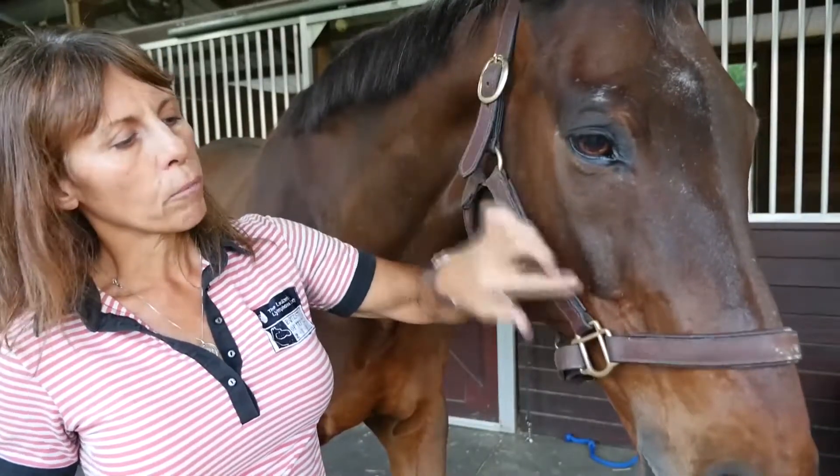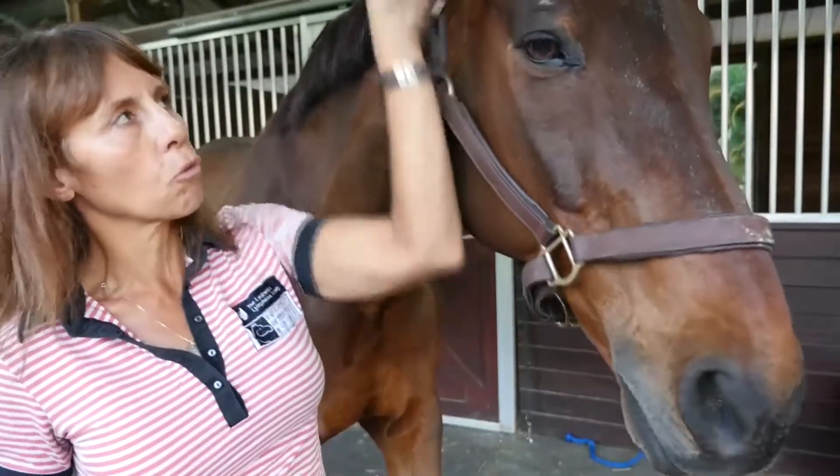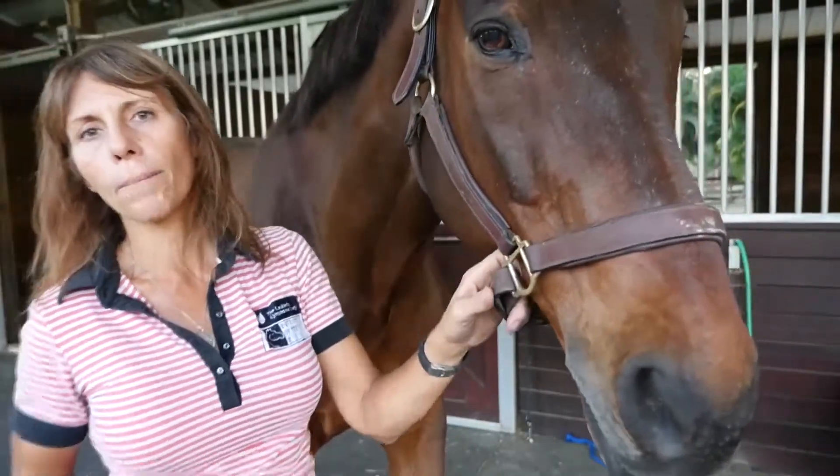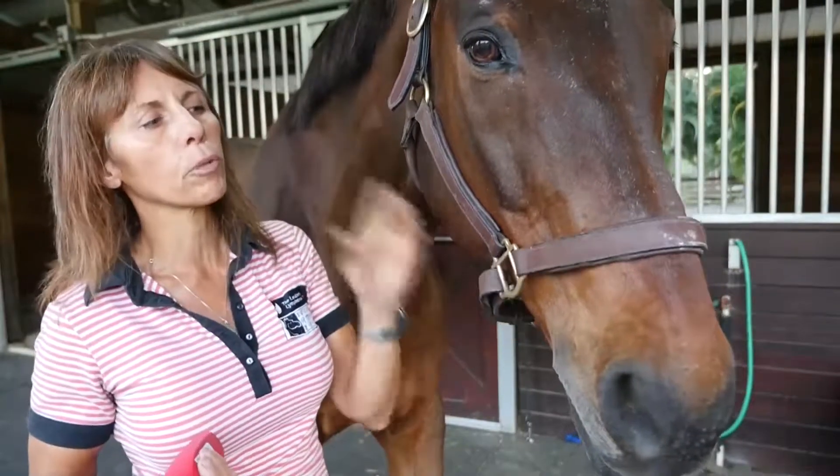We're going to end up with a palsy here with the lips skewed to one side and a drooped ear or an eye droop. In those cases, we might want to use this laser to help stimulate and help reduce that inflammation.